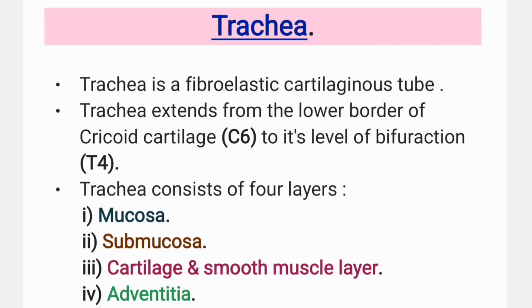Today we are going to study the histology of trachea. So let's start today's topic. We know that trachea is a fibroelastic cartilaginous tube. Now, what is the extent of trachea?